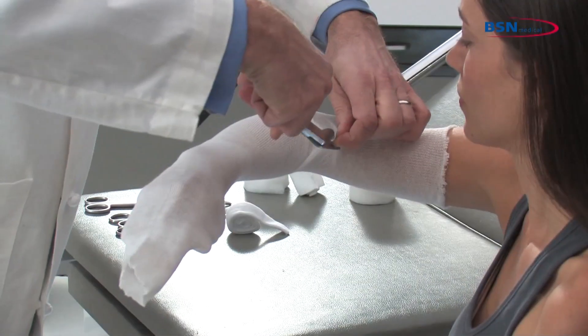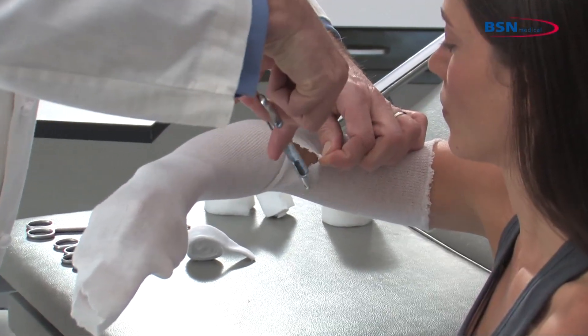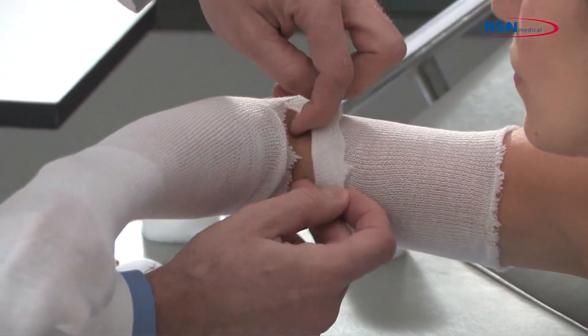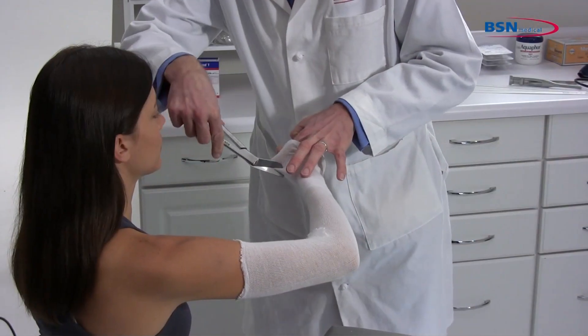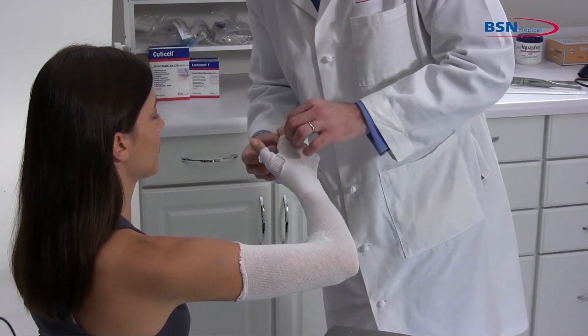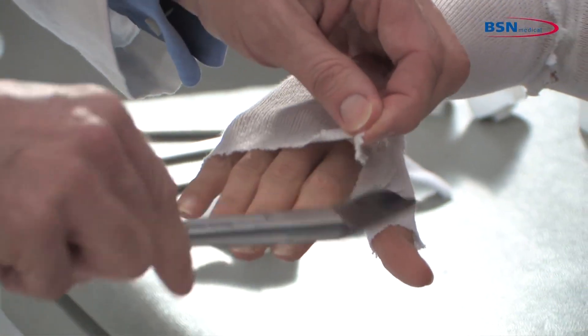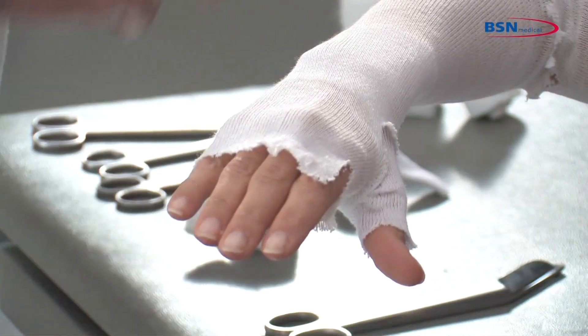A small cut in the anti-cubital fossa may be needed to remove a fold. Make a small cut in the stockinette for the thumb. Next, cut the stockinette at the distal thumb side for easy foldback.